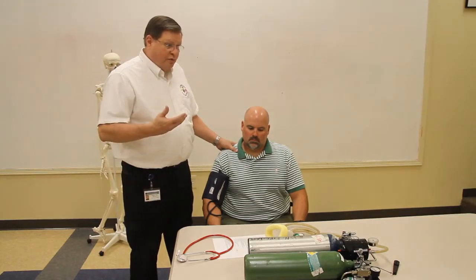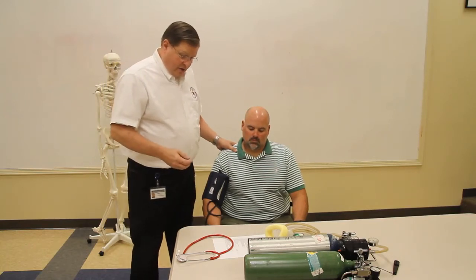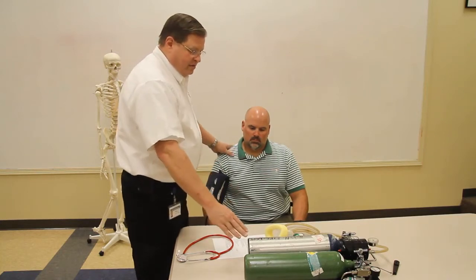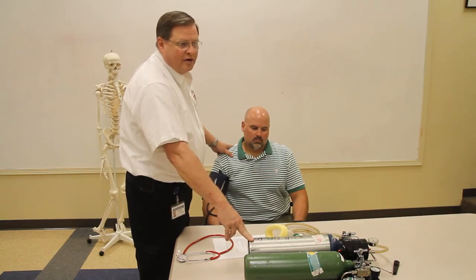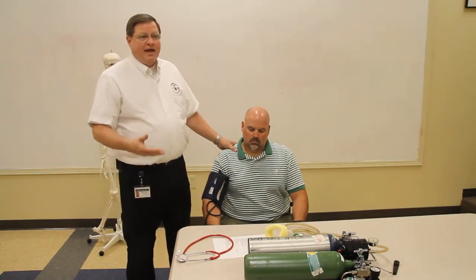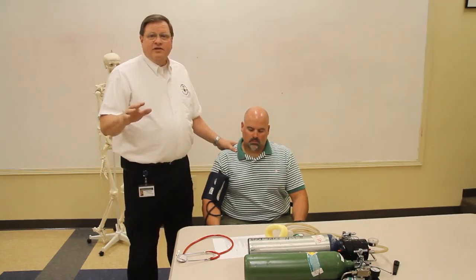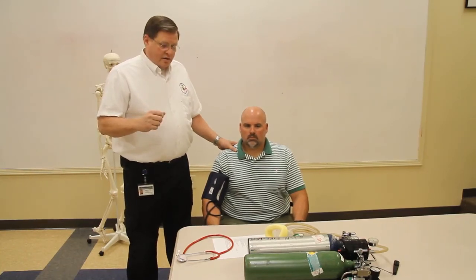Make sure that you put pertinent negatives like the lack of contraindications, and also that because this is a drug, we need to know how much is in the tank prior to using it and how much he has used after we have finished administration. Then what time we began and what time the treatment ended. All of that needs to be documented and make sure that it is on the EPCR. Thank you.